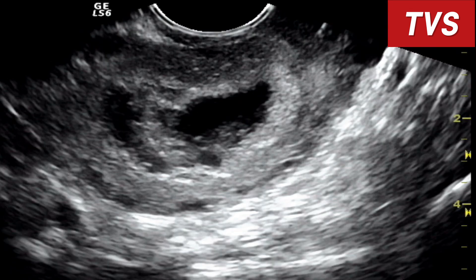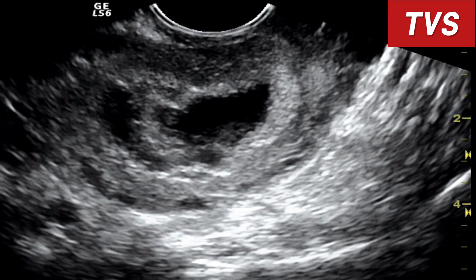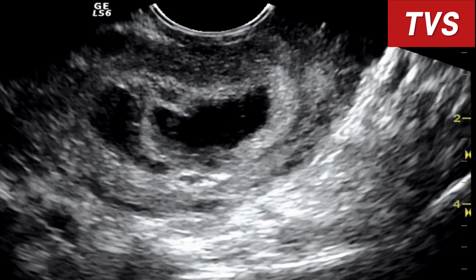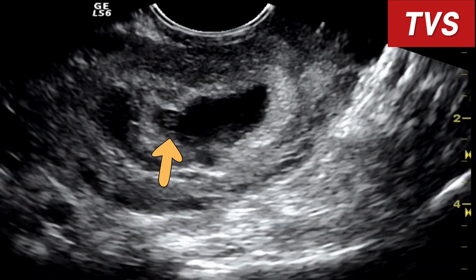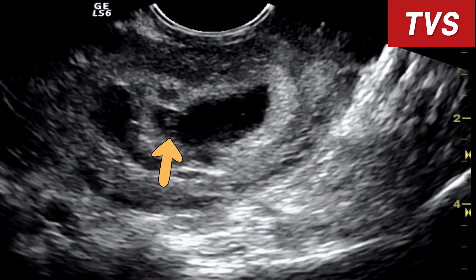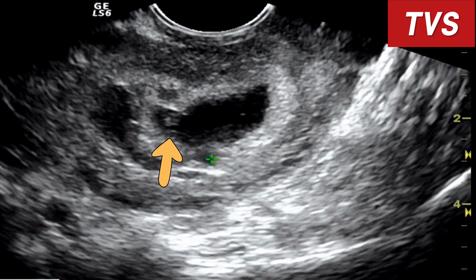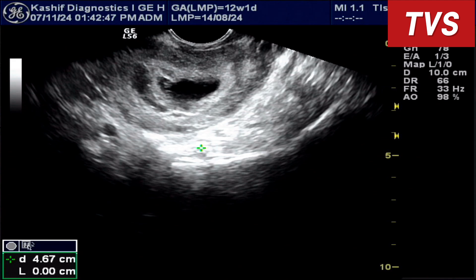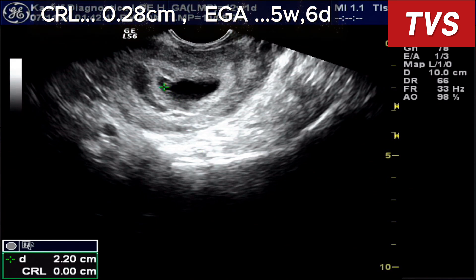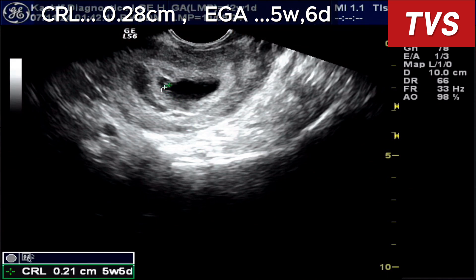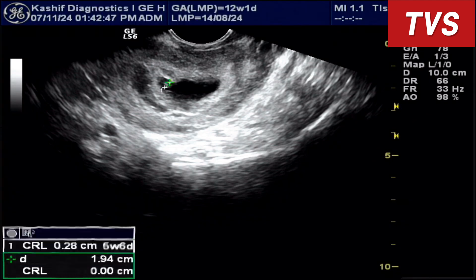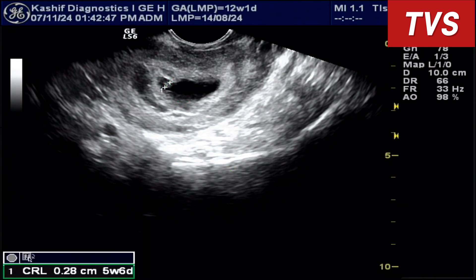A small fetal pole is seen within the gestational sac. CRL is 0.28 cm, corresponding to 5 weeks and 6 days of gestational age. No cardiac activity is seen in the fetal pole.